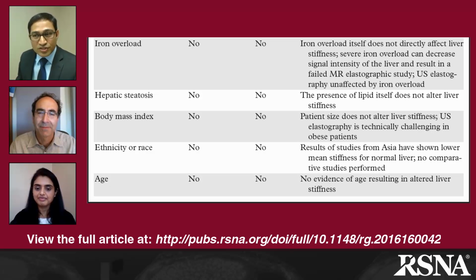But in summary, I would say both ultrasound and MRE are useful for evaluation of liver fibrosis. And we have to pay particular attention to confounding factors such as passive congestion, heart failure, acute inflammation, acute alcohol intake. These can falsely elevate the liver stiffness. And always perform elastography in fasting status and follow up the same in fasting status.